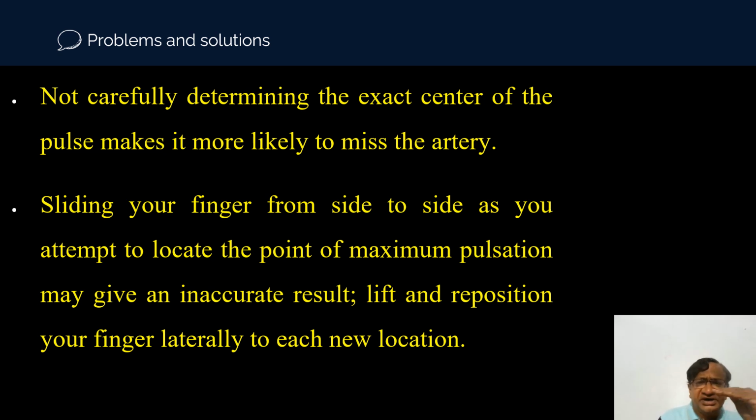Carefully determine the exact center of the pulse. Sliding your finger, we should not do. Put the finger, palpate, get up and put it again. Take up and put it again on this side, medial, lateral, which is good volume, very good volume and easily palpable. Then you go in that side. Slide, no. Lift and reposition.